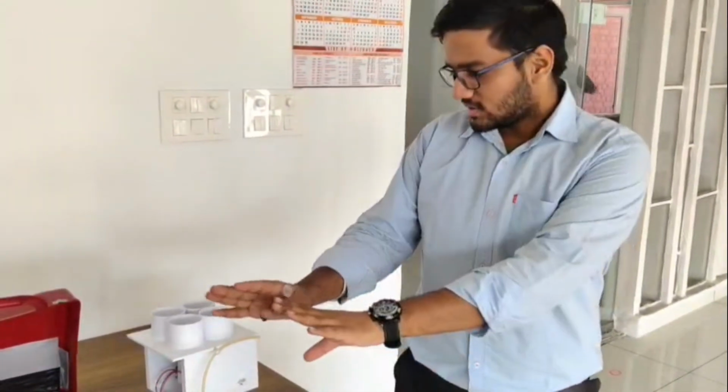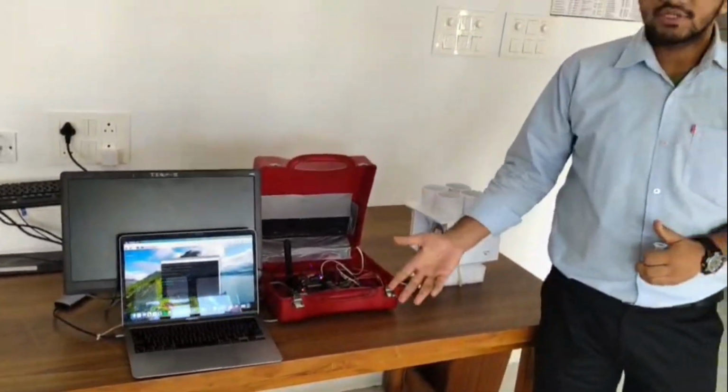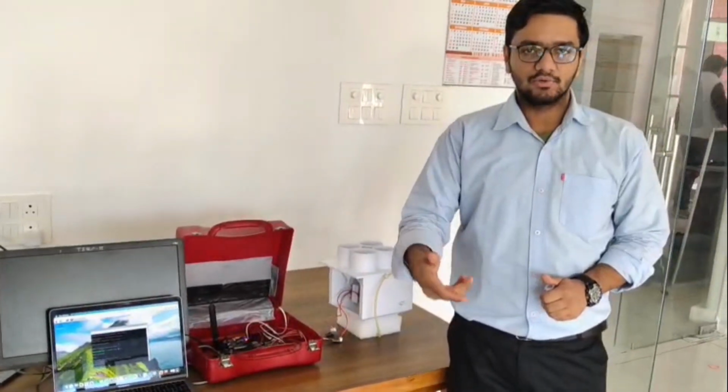And now all the model has been explained by my team partners. So in the future scope, we can also implement Python automation tools to automate all the manual stuff that we need to do. Now, for designing the structural part of a model, we first need to think about what different things we need to design at the very end.